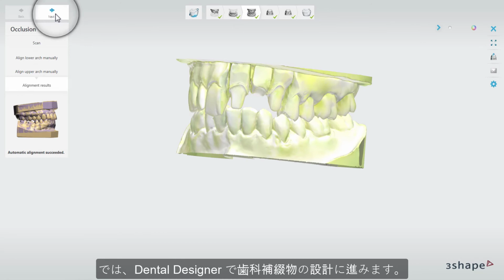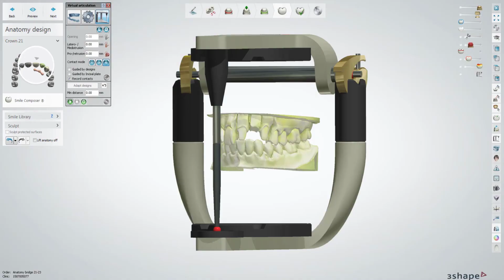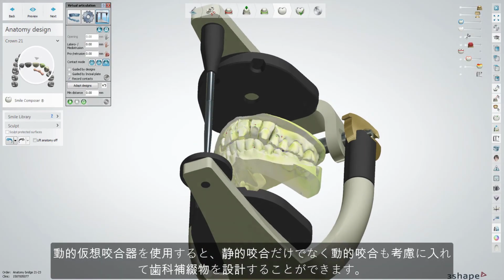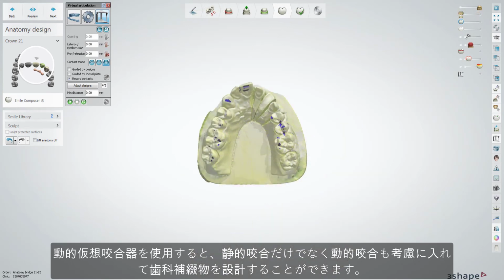Now you can start designing restorations using Dental Designer. Use of the dynamic virtual articulator allows you to design restorations taking into account not only the static but the dynamic occlusion too.